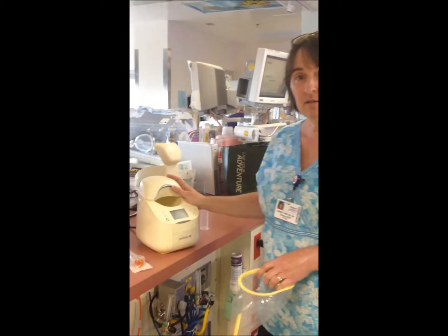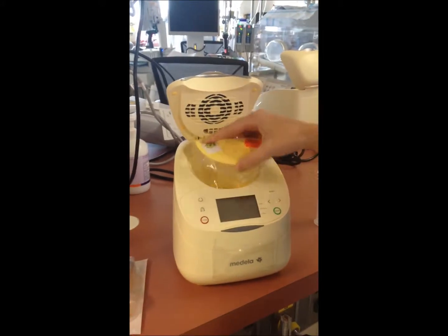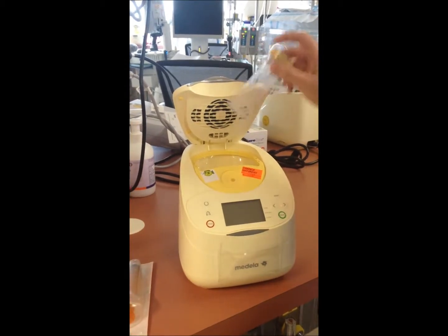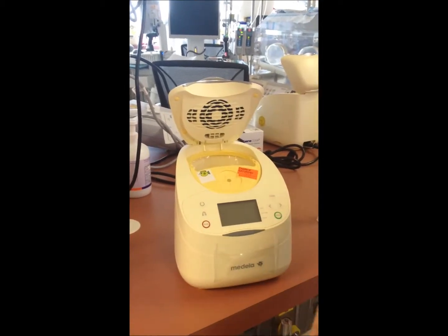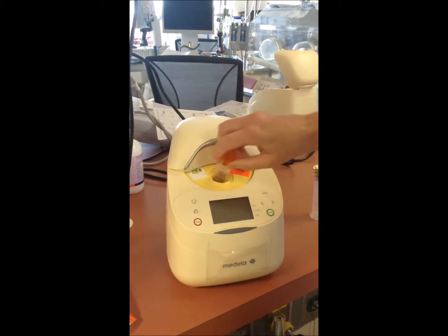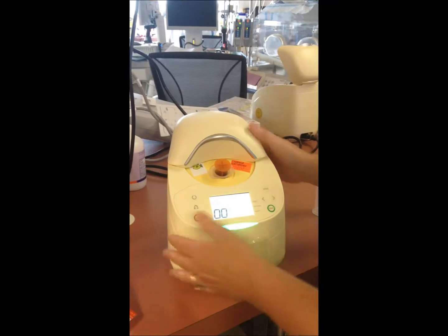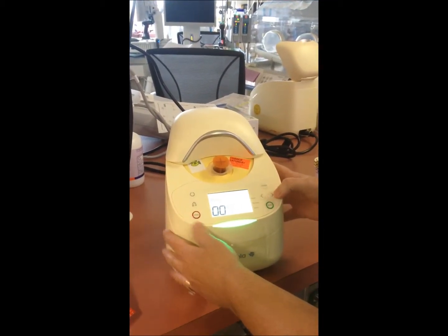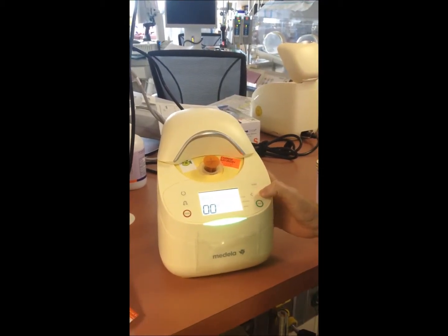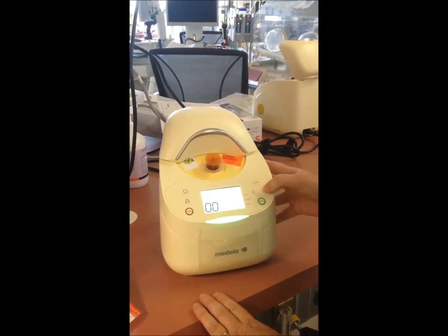So we've gone to these breast milk warmers, and we have a liner so that you're not contaminating between different patients, and you can either use bottles or you can warm syringes, which is what we largely use, and you close it up and you slide your syringe, your container with milk, and it's pretty easy. You set what you want, whether you want it to warm, or we also use this to thaw our breast milk so that we're not thawing too much. We want it just to be still cold and not warm it, which is a problem with using the water like we used to.